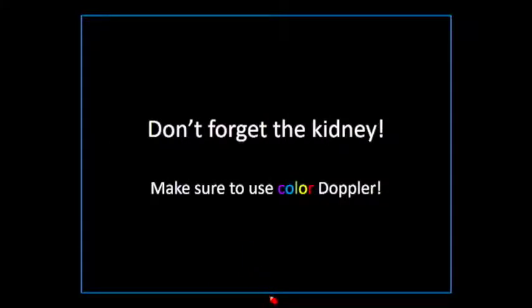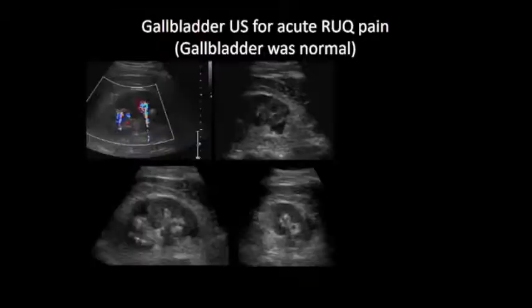Don't forget the kidney. So it's hard. I believe that. I think it's very hard in the emergency room to tell the difference sometimes where the pain is coming from. Is it really in the flank or is it the gallbladder? And that goes for CT as well. And no matter how good the person is, sometimes they'll think it's a stone and get a stone search study and it's the gallbladder or vice versa. So take a look if you're in the neighborhood. You don't have to do an excruciatingly painful, delicate study looking for a small renal cell carcinoma. We're looking for major diagnoses.